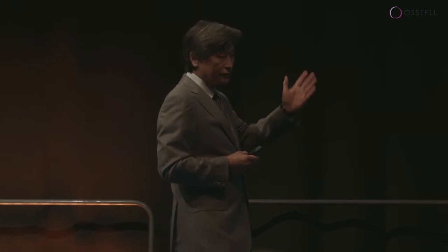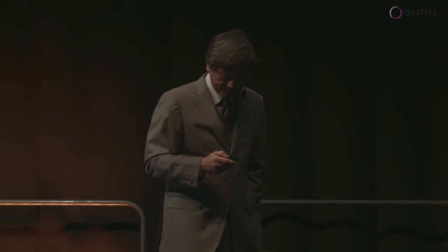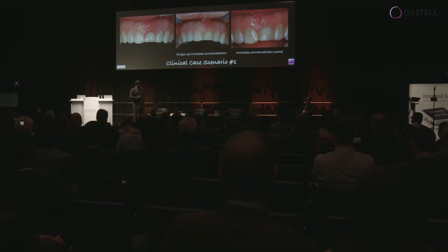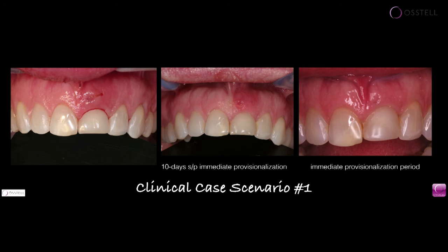And so this tells me that many of you in the audience have experience with Osstell or are using it simply for this decision-making choice. So, that is exactly what I did. I agree with 65% of you. The others, I'm not so sure. But this is what we did. 10 days, status post immediate provisionalization, and after a healing period, you can see the transition.